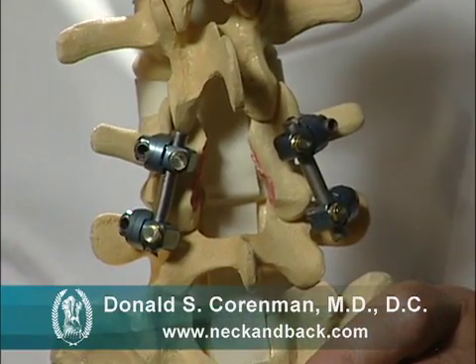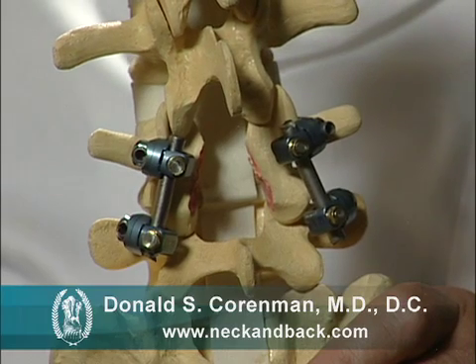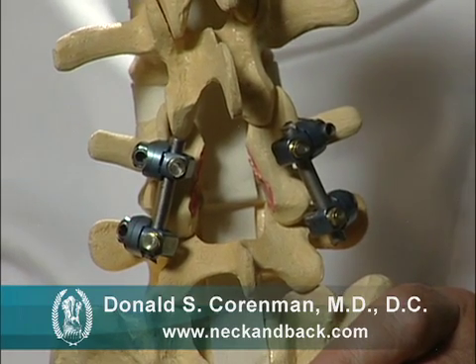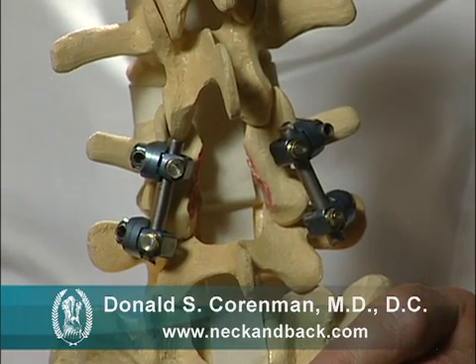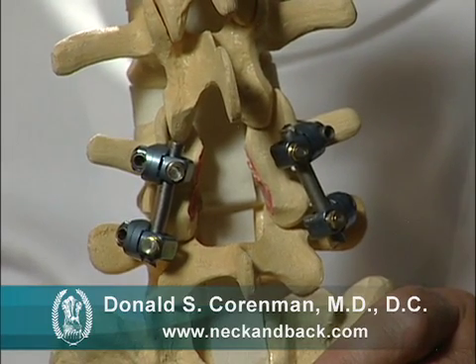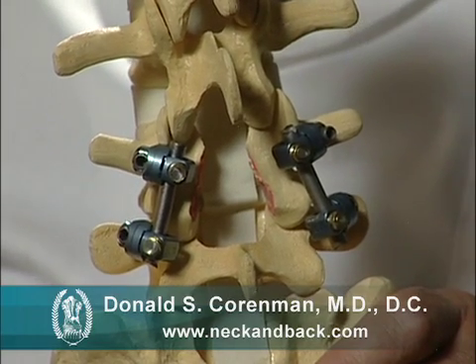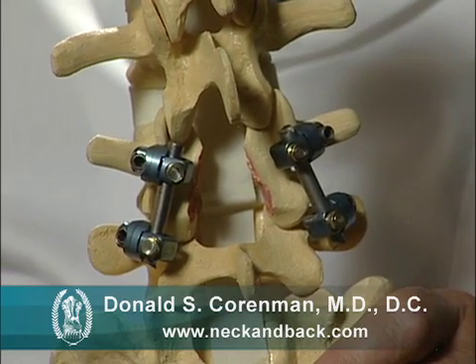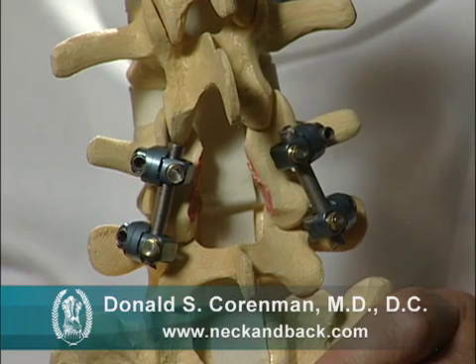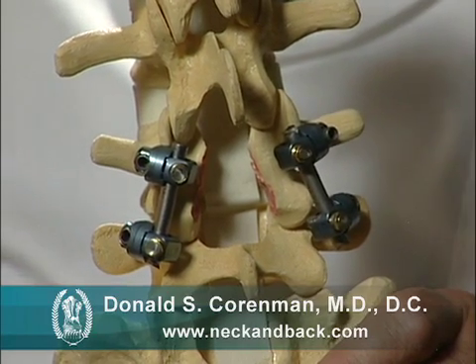We're going to talk about laminectomies and fusions. There are patients who have stenosis — the narrowing of the spinal canal — and an associated degenerative spondylolisthesis, which is the slipped vertebra. If they have enough slip and narrowing of the canal, we need to open the canal and stop the motion of the vertebra, and this is how we do it.